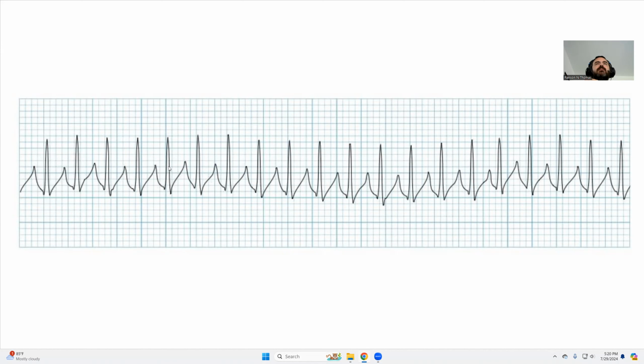Depending on the person, depending on what's happening in supraventricular tachycardia, they can sometimes have a P and a T wave, but they're kind of merged together. Sometimes they don't have atrial contractions at all. What's happening? In the name supraventricular tachycardia, what that means is that the beat is originating not in the ventricles, but at a point above the ventricles, but not in the sinoatrial node, right? So that's why you're seeing this. You're having what could be a normal QRS, but then you're not seeing a P wave.